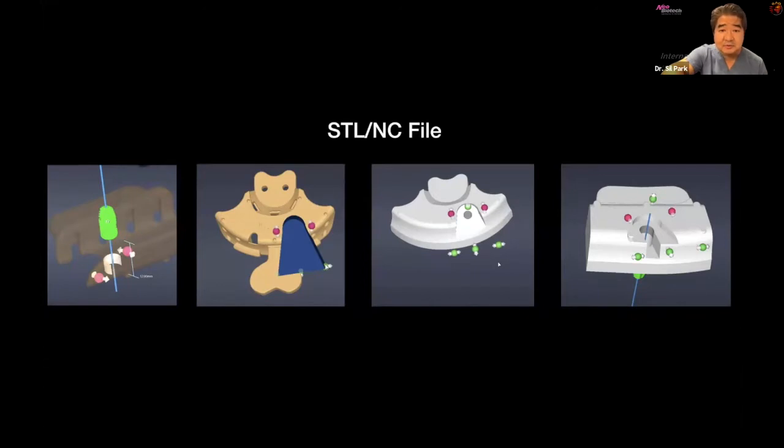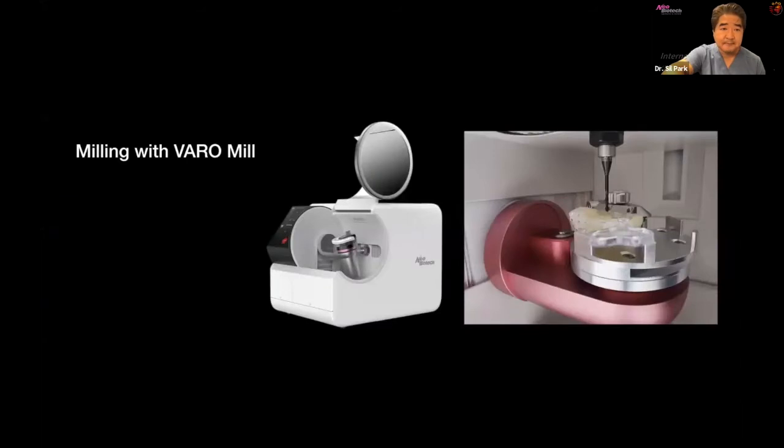So you can make those axes bigger, or on your right side you can have a C shape, so it's more accessible the way you can create it. So it is fully customizable. So you can do this in your clinic, right?